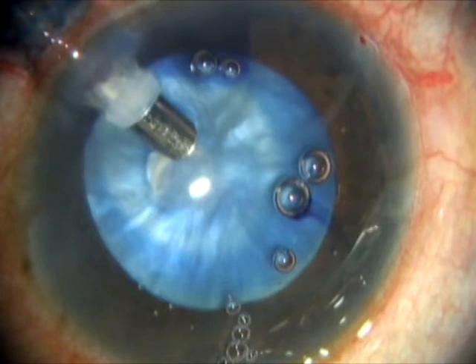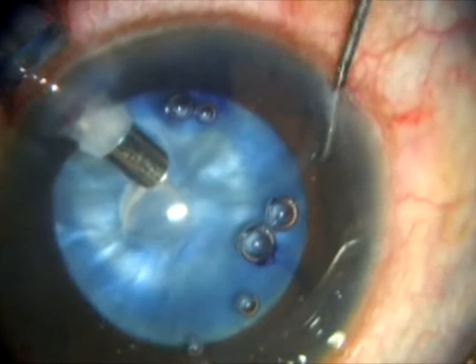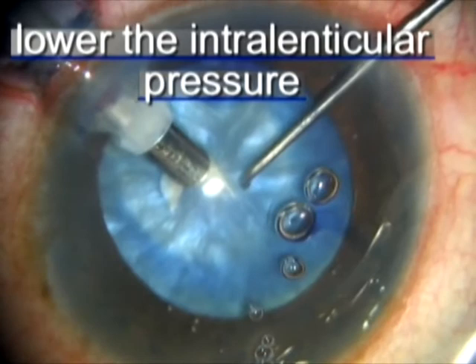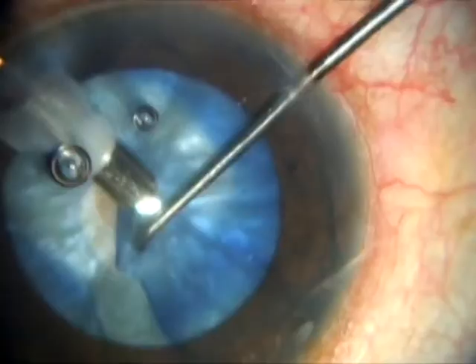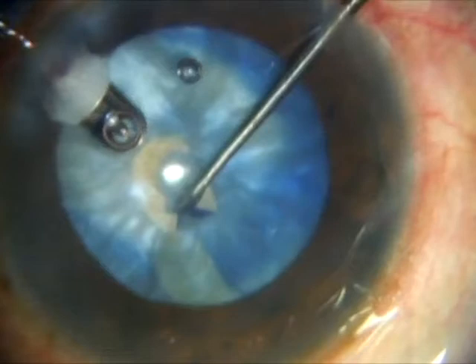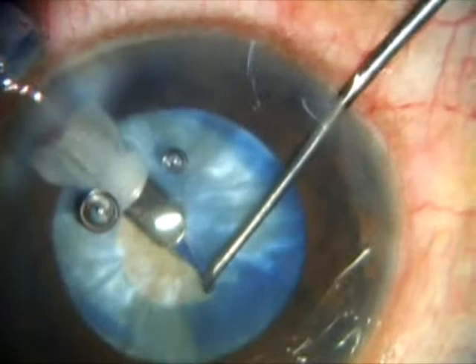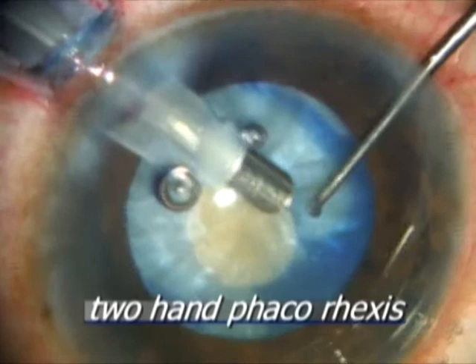Panchorexis can be followed by a technique called phacorexis. In phacorexis, the phaco needle is used bevel down to do the rhexis by aspirating the anterior capsular flap. A bimanual technique using a Sinski hook or rod through the side port is used. As you can see in this video, the capsule is aspirated slowly and steadily with excellent control. This technique — phacorexis — completes the rhexis using the phaco probe with great control, preventing the Argentina flag sign. What you saw in this video is a panchorexis followed by a phacorexis.